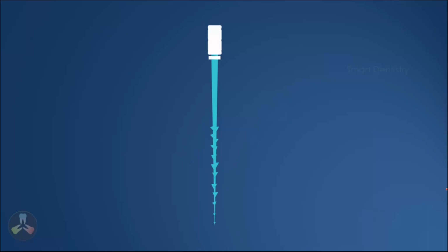The technique that we follow to remove the pulp completely, especially the vital pulp, is very easy. We need only one small instrument, and then we can remove it easily. That instrument is called a barbed broach. It looks like a file, but instead of the cutting edges of a file, it has small irregular barbs cut into irregular shapes. We have to find a broach which is a little smaller than the expected canal size, and put it inside the root canal.